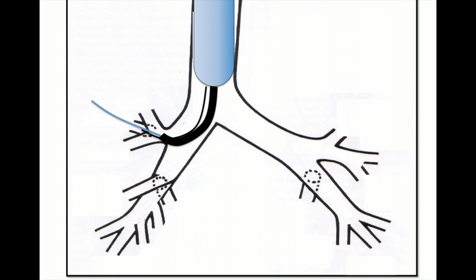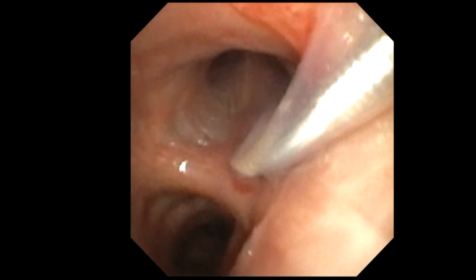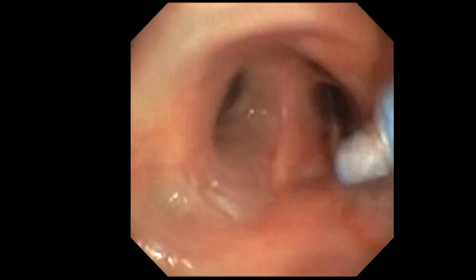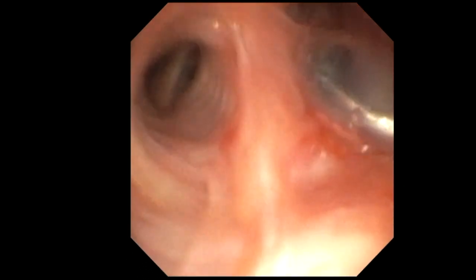After freezing for a few seconds, the cryoprobe is then withdrawn along with the bronchoscope while the balloon is inflated to tamponade any significant bleeding. In this case, a 4-French endobronchial balloon is placed in proximal RB2. The position of the balloon is then checked, and one of the procedural assistants is trusted with the sole responsibility of operating the balloon and ensuring it stays in place. The proximal end of the balloon can be taped to the rigid scope to facilitate the process.